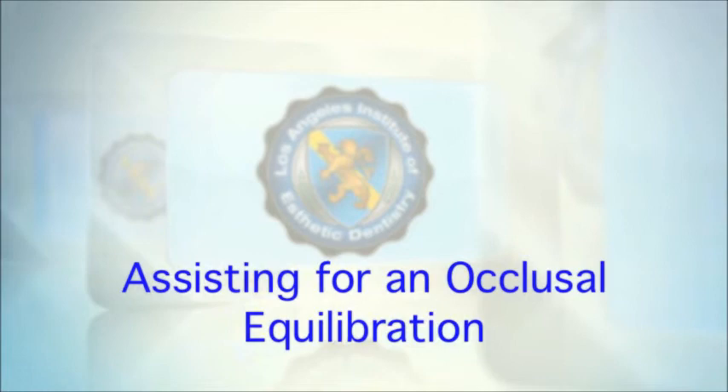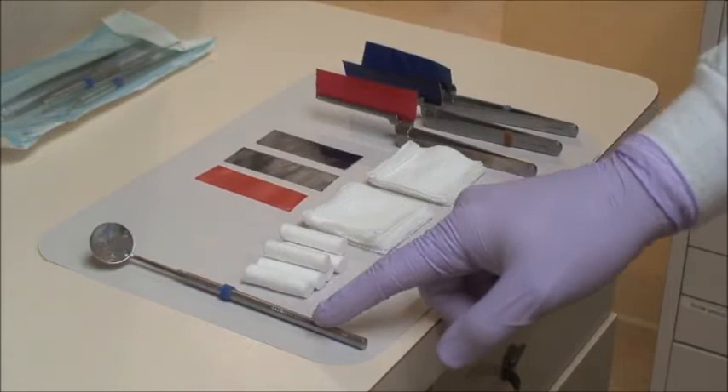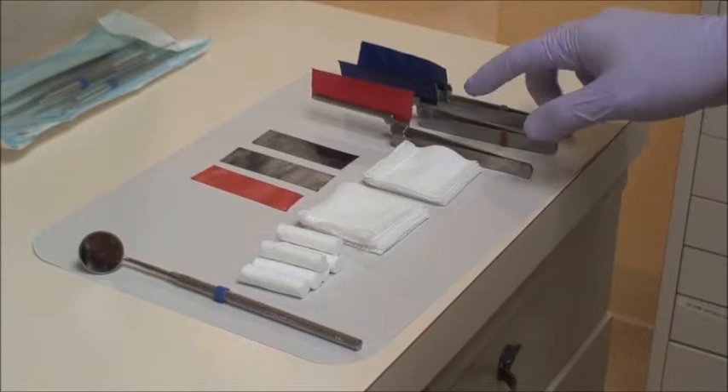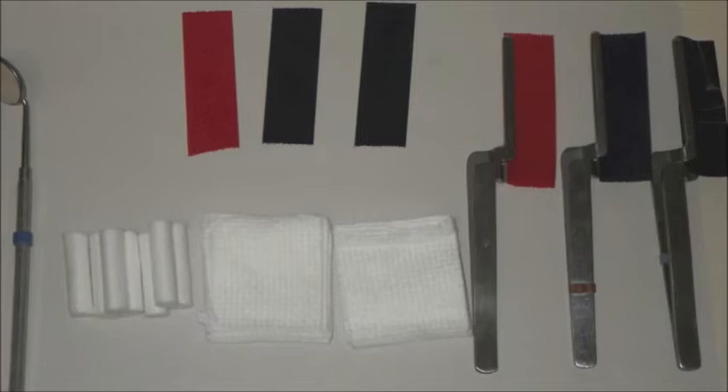Hello, this is Dr. Ruiz. I'd like to share the armamentarium necessary for a full mouth equilibration. You'll need a good quality mirror, plenty of cotton rolls, gauze, and two articulating paper pliers — one for the blue articulating paper and one for the red. I like to have my assistant keep a few spare articulating paper squares ready.